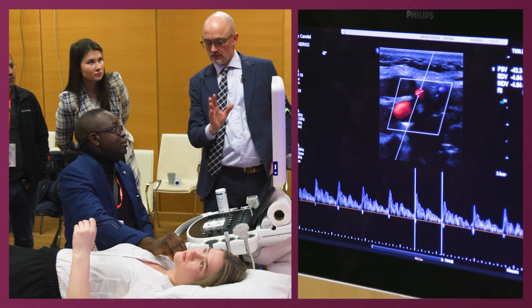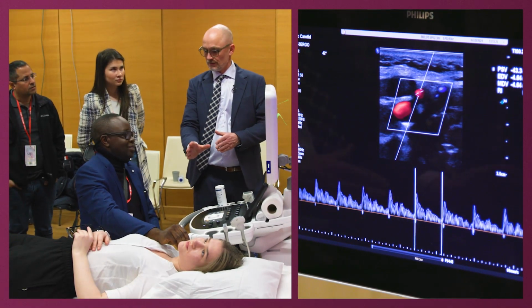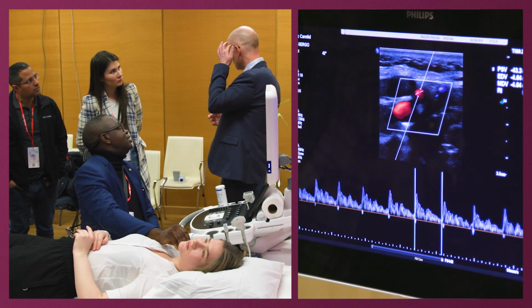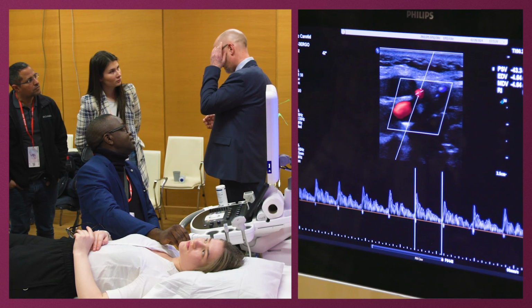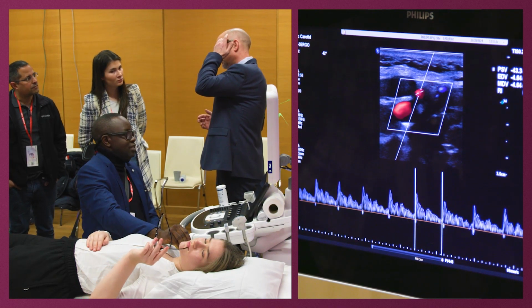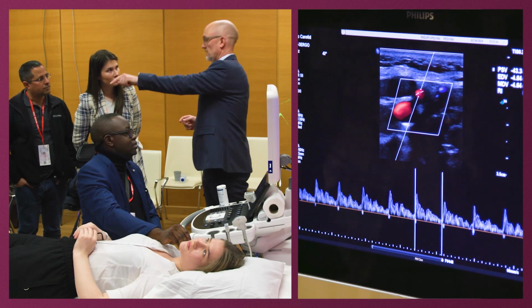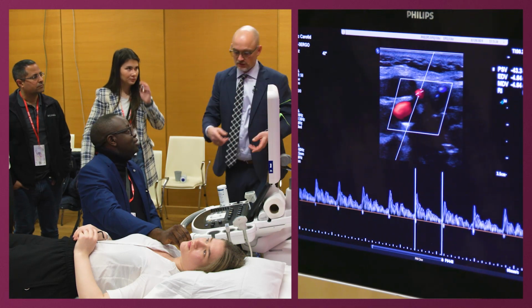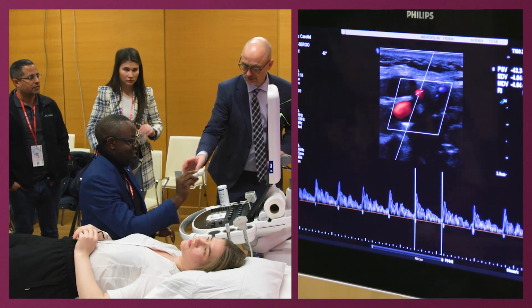The position is not optimal. But that is a trick. You find the temporal bone, and then if you're in doubt, you should palpate the pulsation of the temporal artery, and if you hit that, you push blood back into the external, and you can see that on the flow curve. I think you should. Let's change around so we can give another colleague a chance.